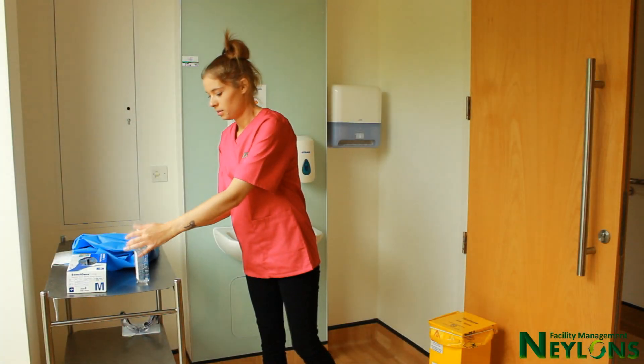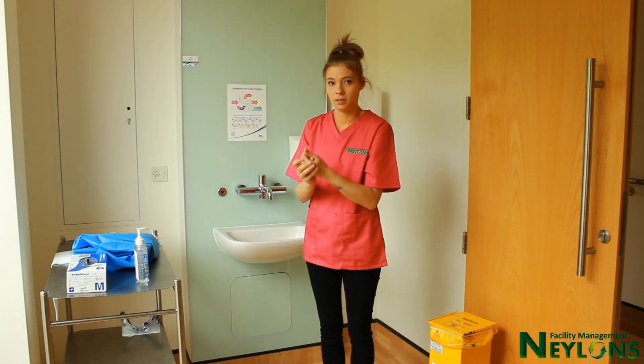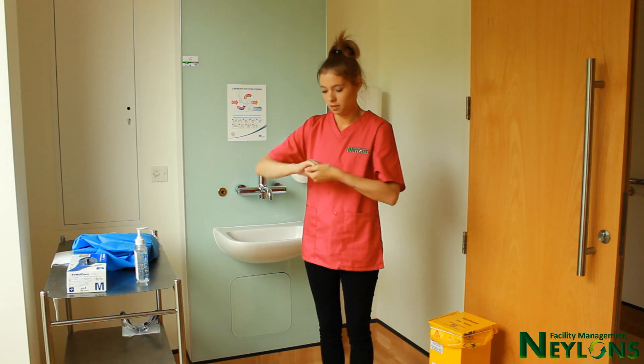In this training video, we will show you how to don and doff personal protective equipment. When donning PPE, these steps should be followed.